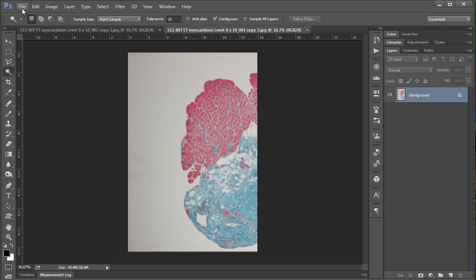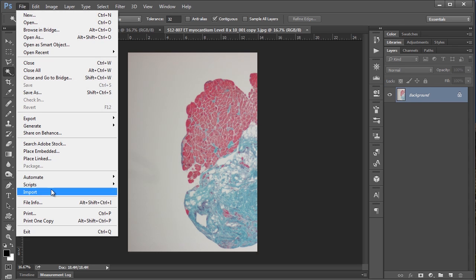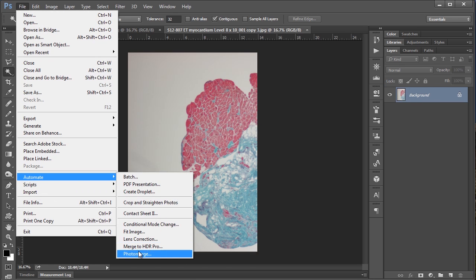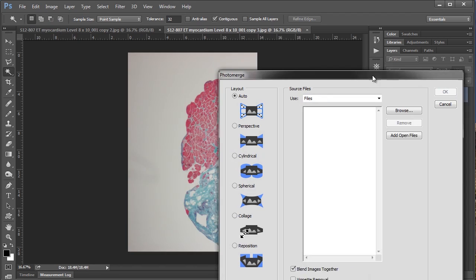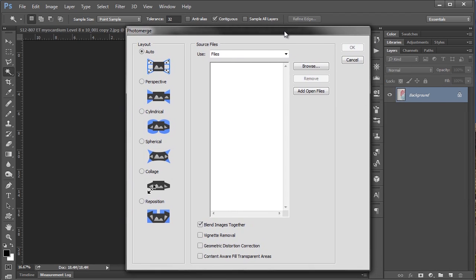And you can get to that by going up to file and saying automate and going to photo merge. And so that brings up this dialogue box here with a couple of different options. In terms of layout, if we just select auto that's going to be perfectly fine for our purposes. You could choose reposition because that's really all we're doing. There's going to be no distortion just from taking direct photos from a microscope. But auto is fine.